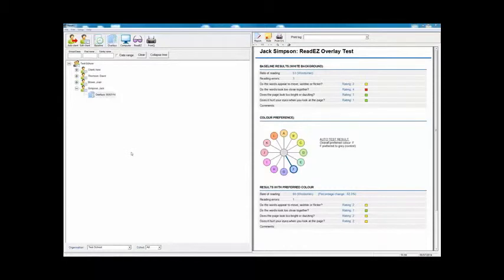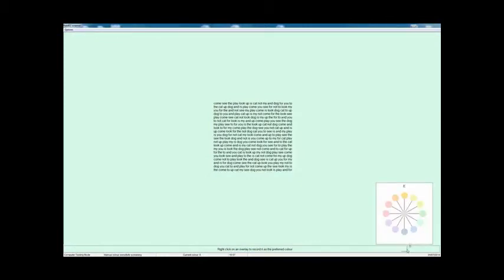That's the job done as far as overlays are concerned. Overlays may be perfectly adequate for your patient and you may never need to move on from there. But for people who get a significant benefit from using overlays, they might also want the same benefit for writing and also for seeing the whiteboard. So you can actually do the test for ReadEasy Glasses. The test is almost identical to what I demonstrated for the overlays — the only difference is that the whole screen is colored rather than just a patch. You should do this with the room lights off so that the only thing within the visual field during the test is the colored screen, and that simulates the effect of a tint.